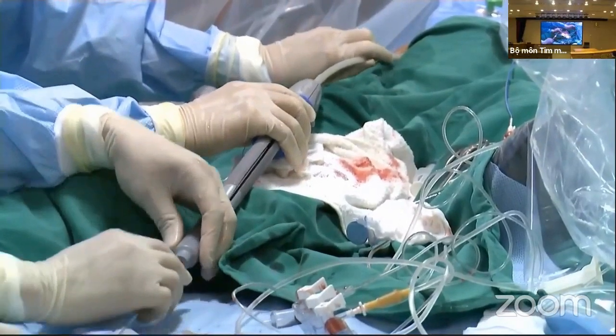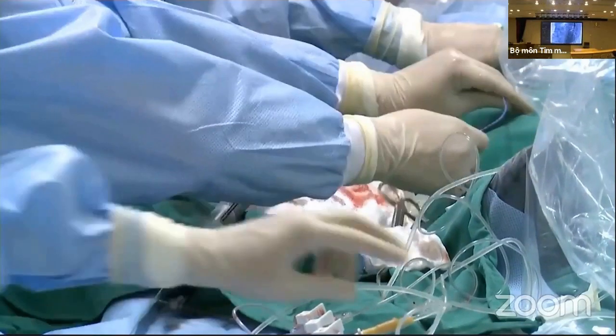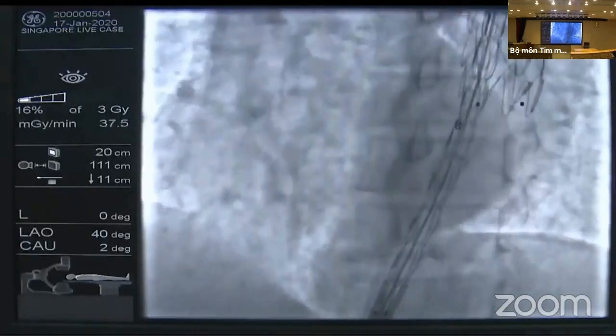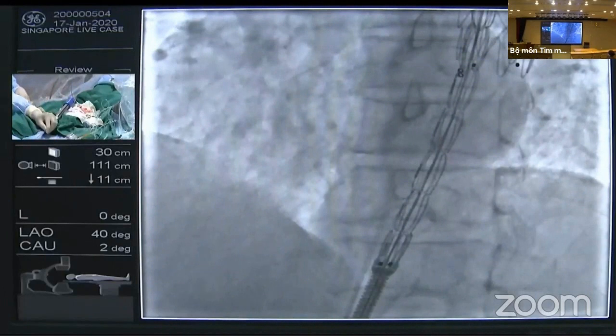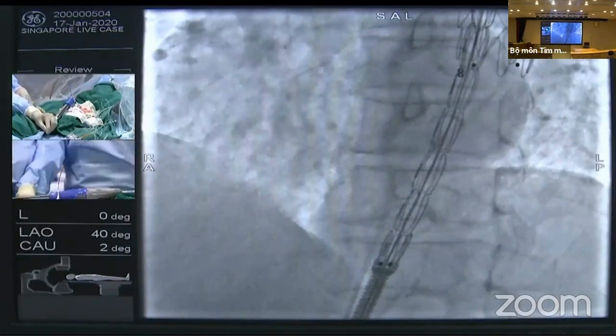But I think the other thing we also do, in addition to making this hole, is you can also preload them with a wire. And once you have the device there, then you can start fishing it from the femoral end as opposed to the subclavian end. Snare it, is that correct? Yeah, snare it. That sometimes helps. But I'm hoping Gore and Cook and a couple of other companies should come out with this. But the short answer is it's usually done as teamwork.